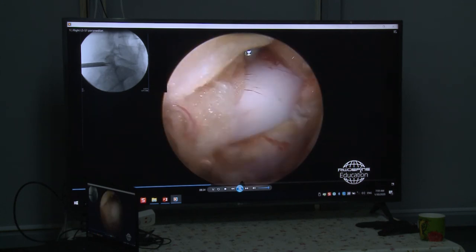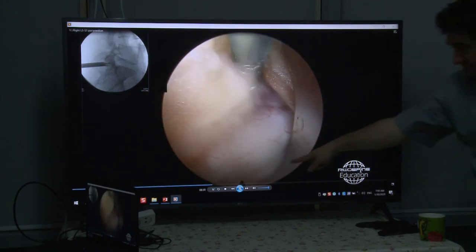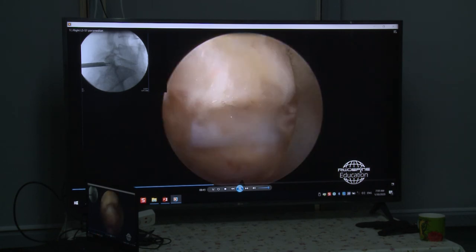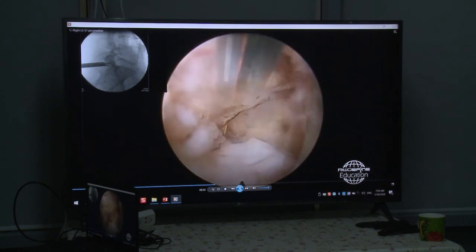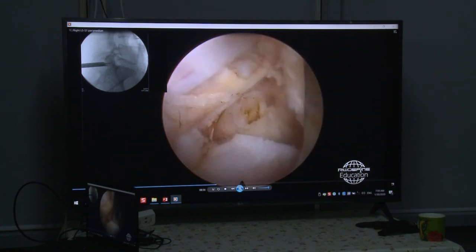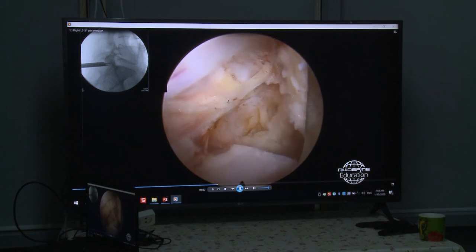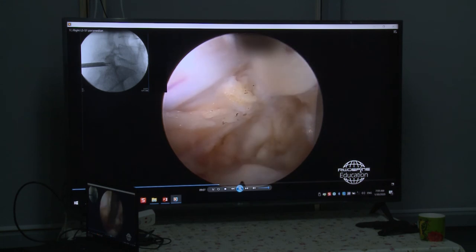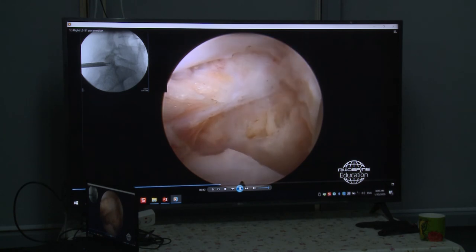But if we don't see that here, maybe we have to prepare more medial of the fat tissue here, until we see also here there are some small vessels, of the veins. So before I mobilize the neural structures medially, if it's possible, we coagulate the blood vessels here, and we see already here adhesions between the nerve and the fat tissue. That is in all cases of these herniations when they are a little bit older.